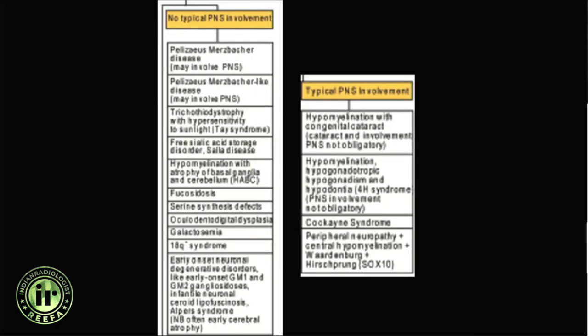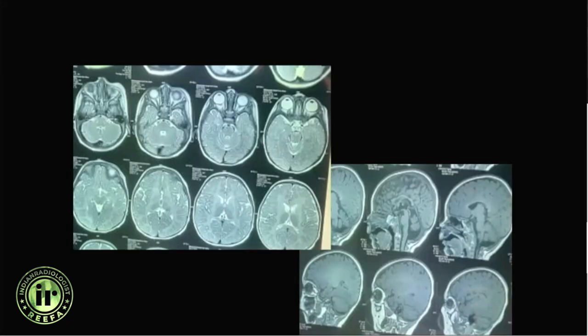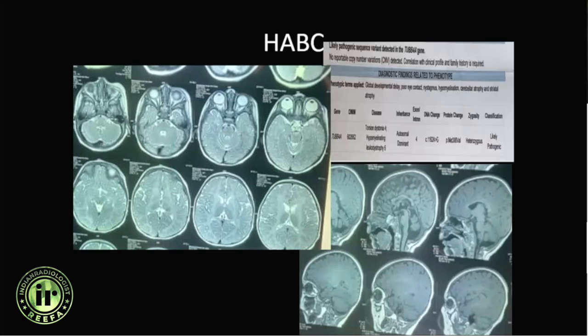Some hypomyelinating disorders can also have peripheral nervous system (PNS) involvement. Another patient with diffuse white matter hyperintensity and hypomyelination also had hypoplastic basal ganglia and cerebellar hemispheres. Genetic testing revealed a TUBB4A mutation, and this was diagnosed as hypomyelination with atrophy of the basal ganglia and cerebellum.